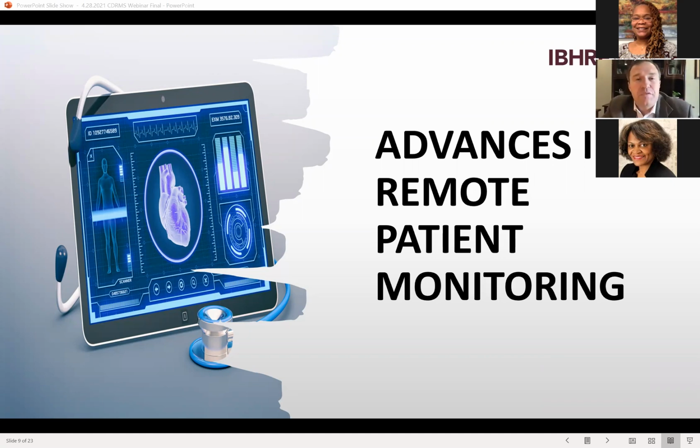I think back and reflect on my own experience as a fellow in electrophysiology, and what I knew as a fellow was that someone came out of thin air kind of, with a remote that said that the patient had a fractured lead or their device was at ERI. And I didn't really give a lot of thought at that point in my career as to how that information got to me. All I knew was that that patient needed to have their lead replaced or they needed to have their generator replaced. And that was my focus.